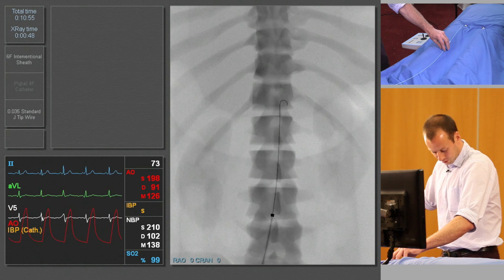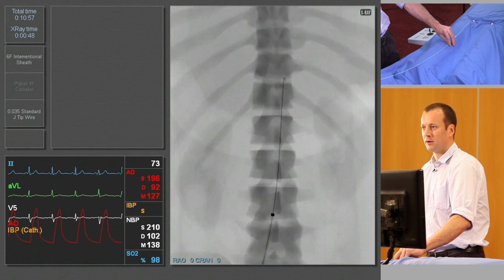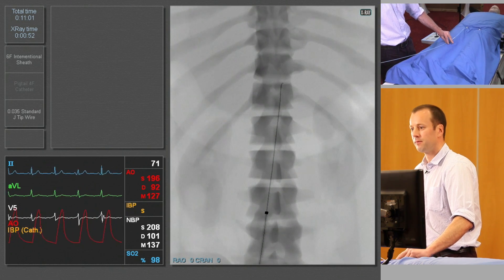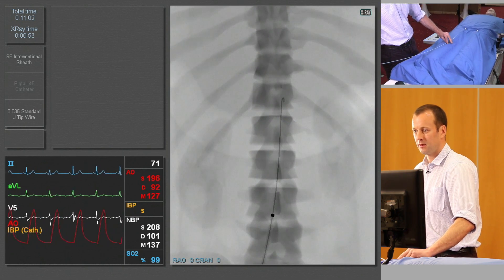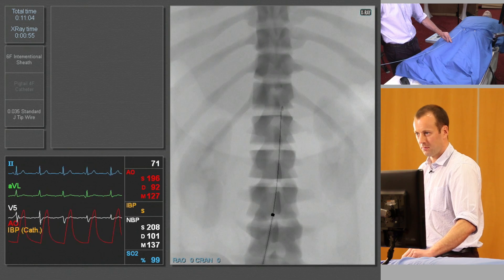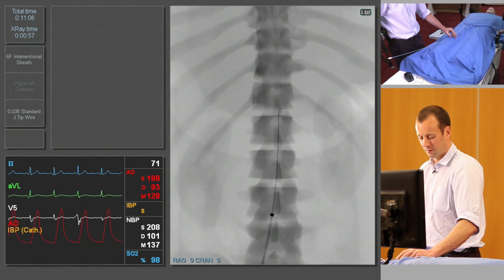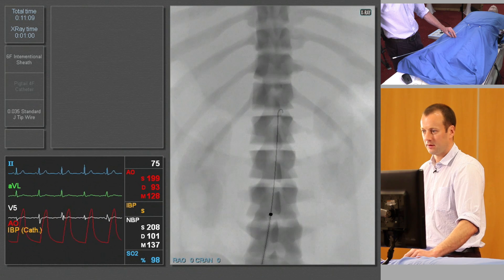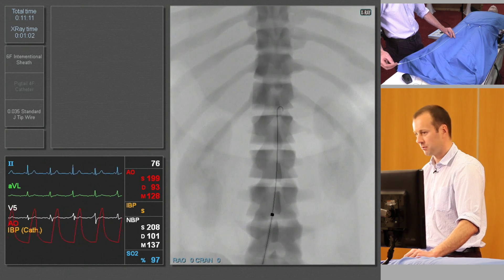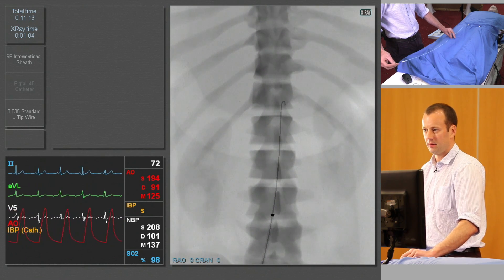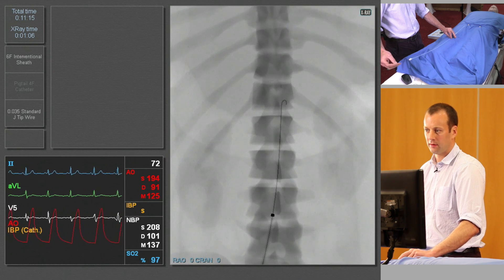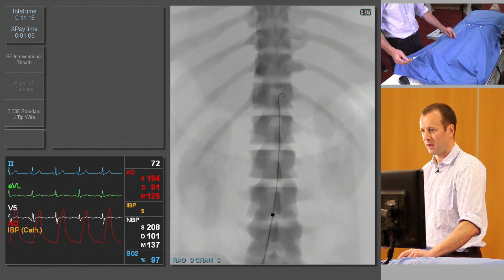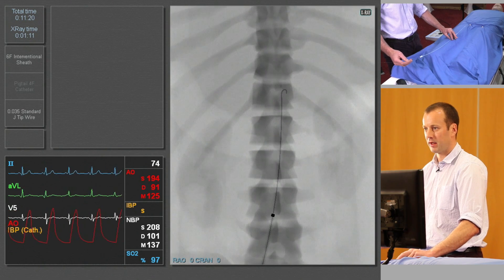In these circumstances you need an assistant or long arms. My right hand is now controlling the back end of the wire, the sheath is controlled by my left hand by my little finger, then my index finger and thumb are advancing the catheter. And we'll see that appear in the abdominal aorta.